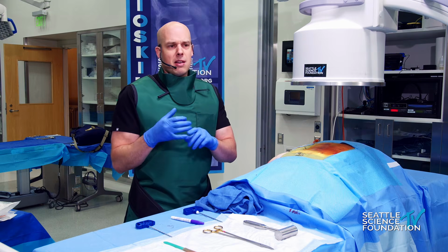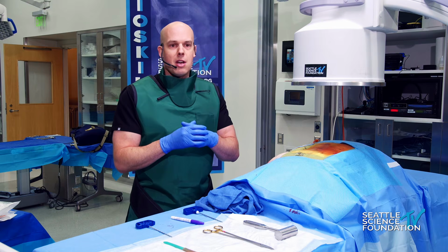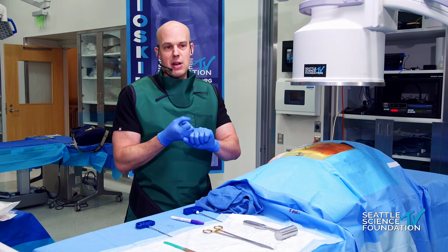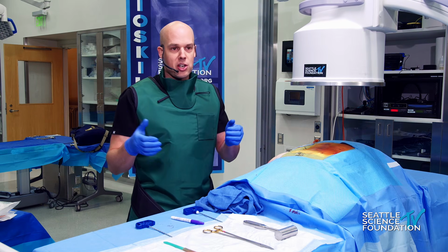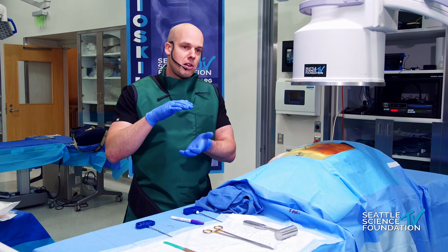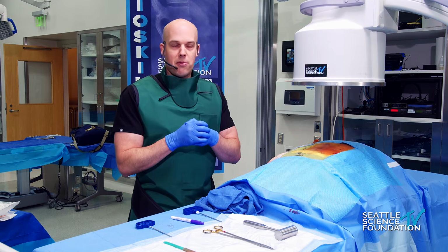If you calculate the volume of the vertebral body and you inject about 15% of the volume of the vertebral body, you'll be increasing the strength of the vertebral body. If you inject 25%, you will be maximizing the pain relief for this patient, and at 30%, you increase the stiffness of the vertebral body. So you'll be restoring the biomechanics of that vertebra.